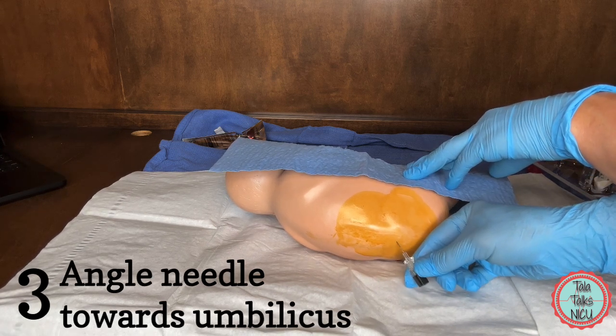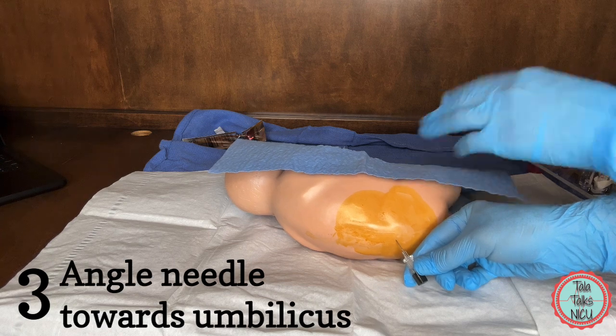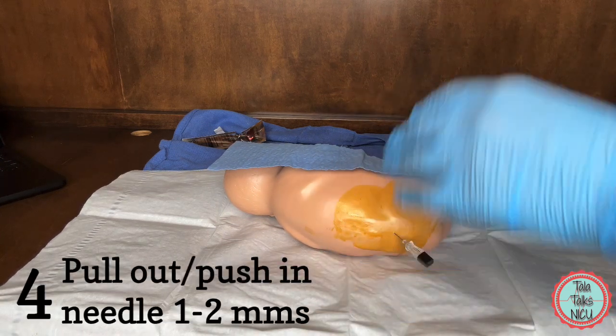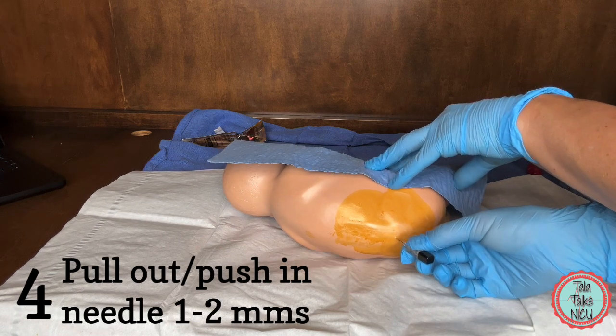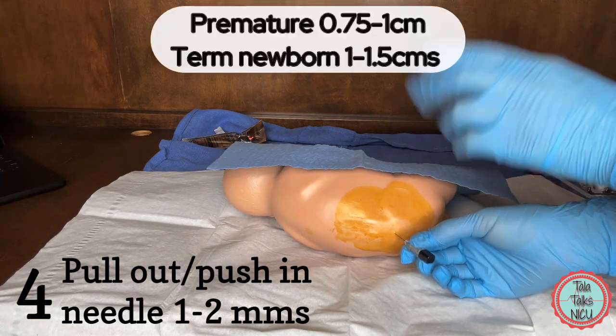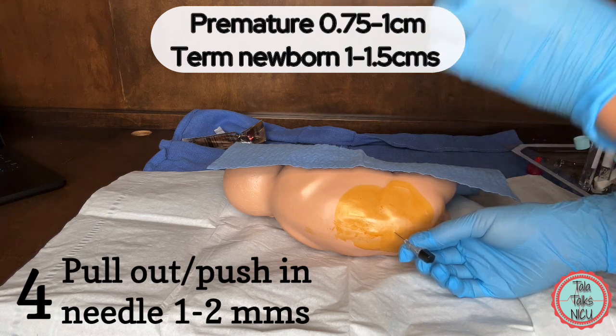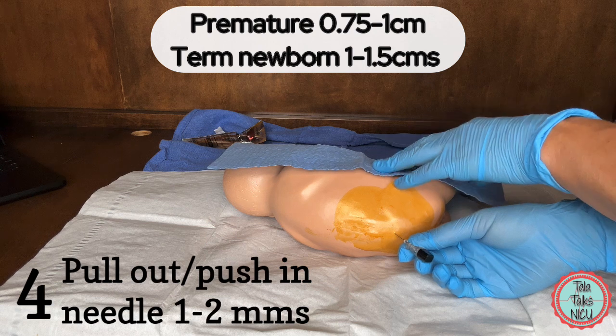You're not angling it towards one of the shoulders, where you have it at an angle from the surface that you're on. Four: you've pushed the needle in too far or not far enough. In a term newborn, that's about one to 1.5 centimeters. In a preemie, it's just under one centimeter — so between 0.75 to one.